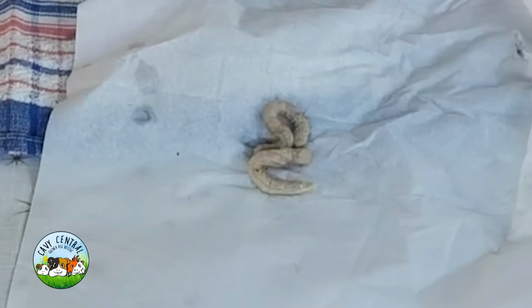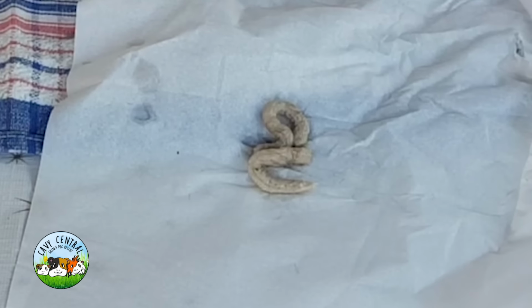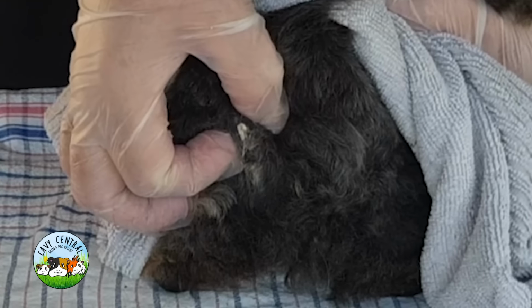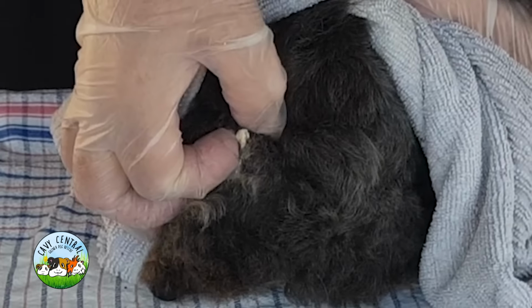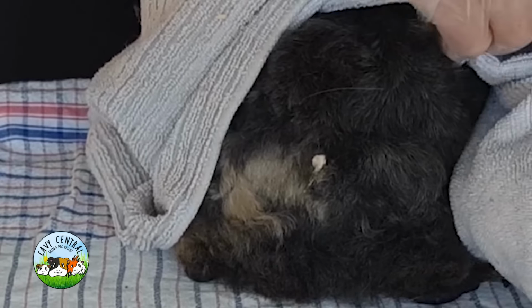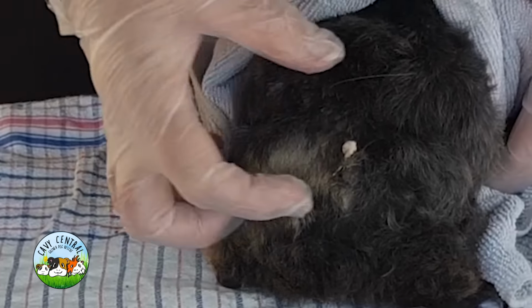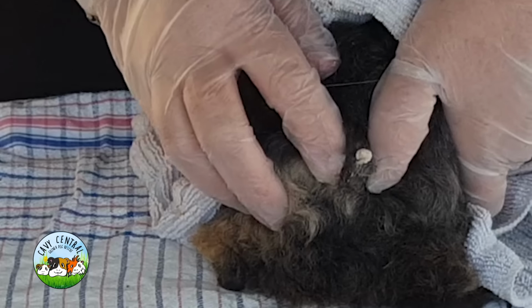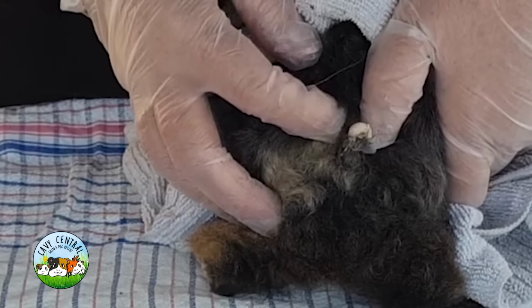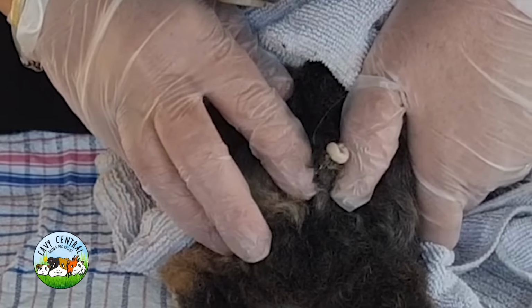I'll put that down there. So the colour of it is brown, which quite often they're grey. Yeah. And there's loads of fluid in there. Little fluid specks keep popping out. But you find, sorry, this is another reason you put a cloth there, so they don't bite your wrist. Yes. Because she's just flipping around, she will nip. She's just saying, get off, but it's okay. We need to do this. And you'll notice in underneath here, I'm just pushing forward, like a pimple, a really big pimple. But literally, that's all coming out beautifully.